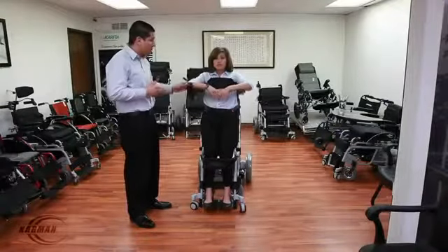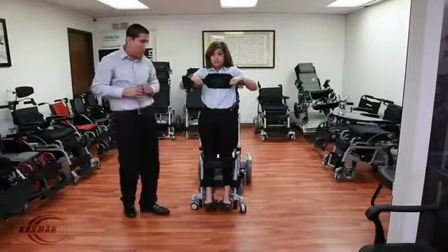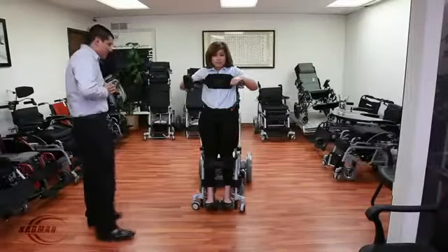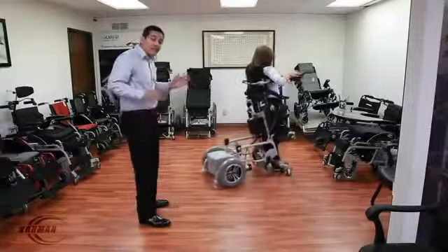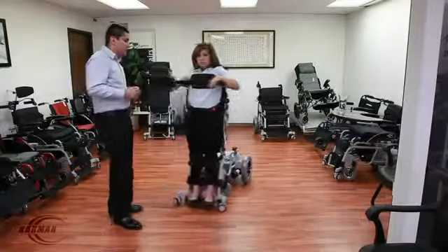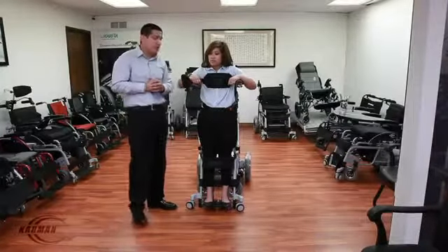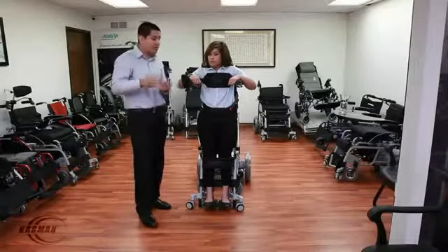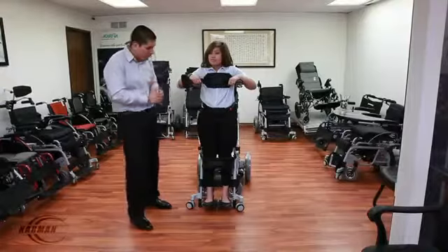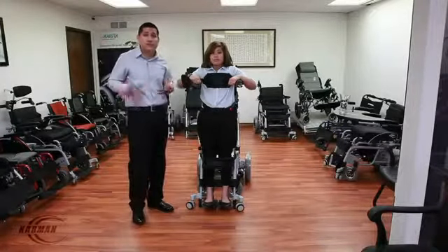I'm going to show you guys the fully standing position right here. The main feature on this chair is that you are able to drive in the fully standing position. As you see, in the full standing position, you are able to drive the chair. In the standing position, one of the main safety features is a speed inhibitor — this restricts your speed when standing. This ensures safety, so that the loved one or patient, if they do not have good control over the joystick, will not go too fast and hurt themselves or anyone else.